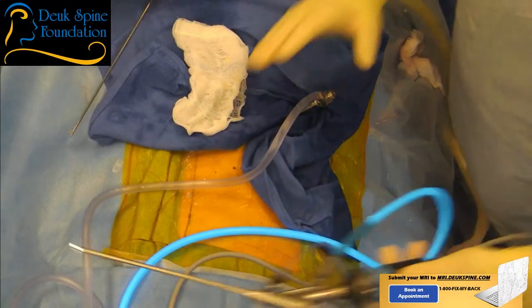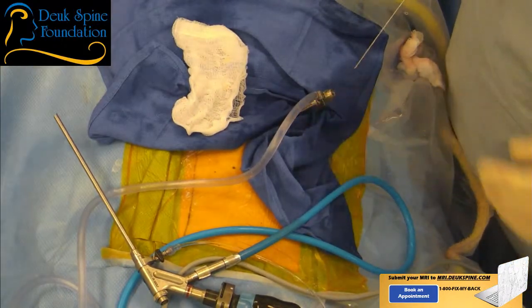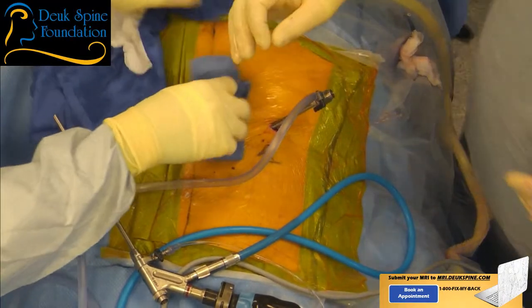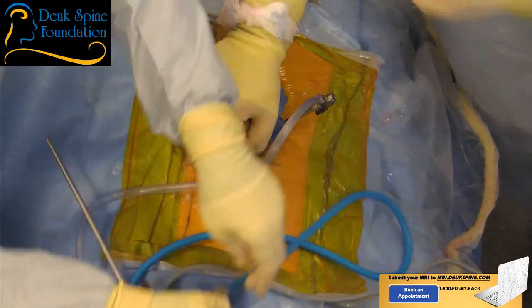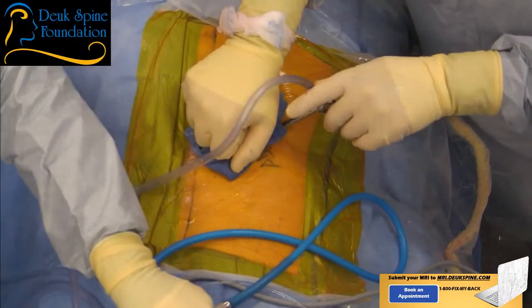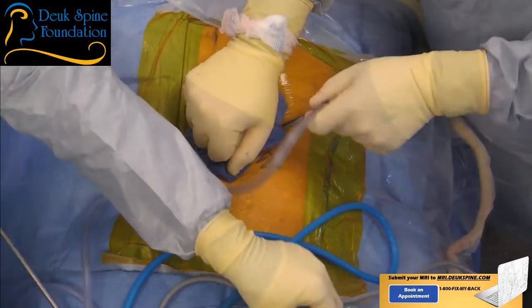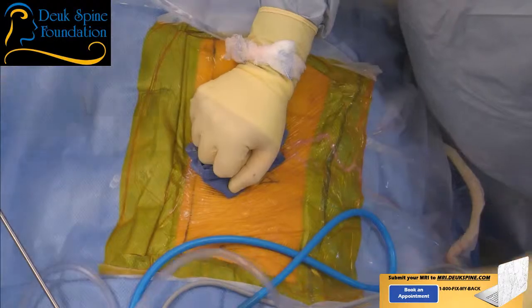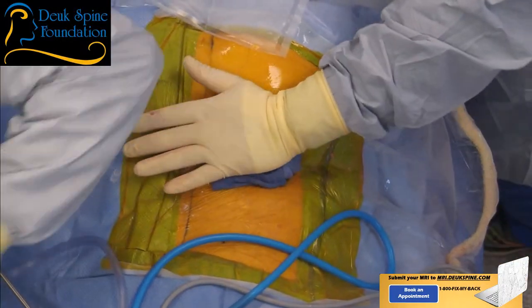So just in case you're wondering, scope off, this is not a beginner level surgery for endoscopic surgery, okay? This is a level 10 out of 10. This is the highest, most complicated, most difficult. So if you're just starting out doing transforaminal endoscopic surgery, do not start with a case that's like this much scoliosis. You want to avoid scoliosis, you want to avoid listhesis, and you don't want your discs to be too collapsed. This patient had every anatomical feature that makes this surgery virtually impossible.